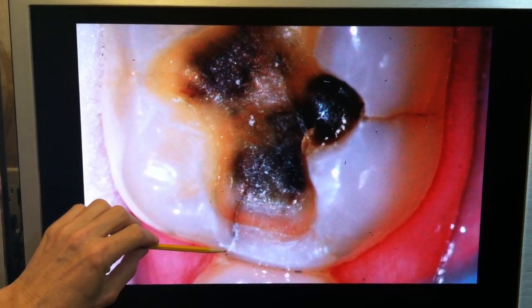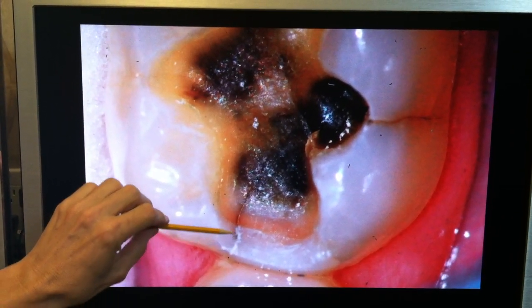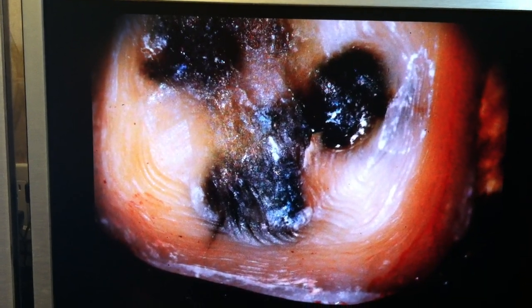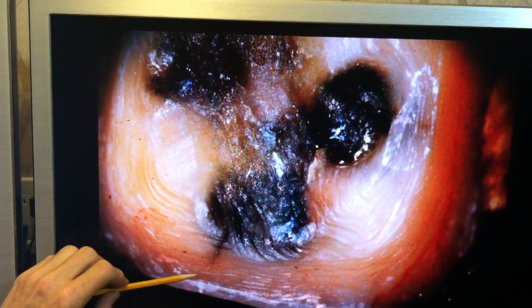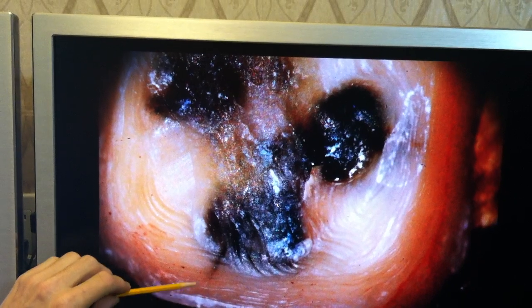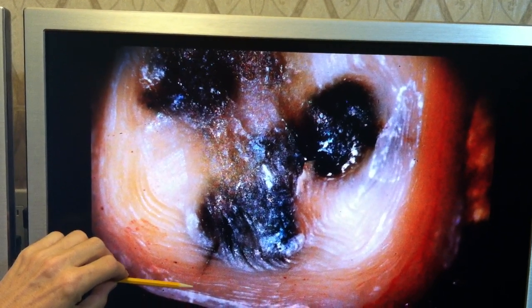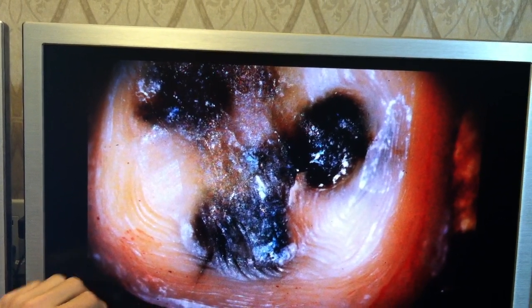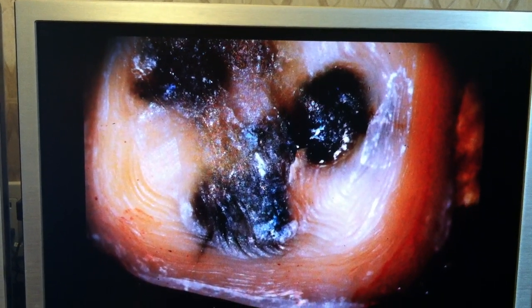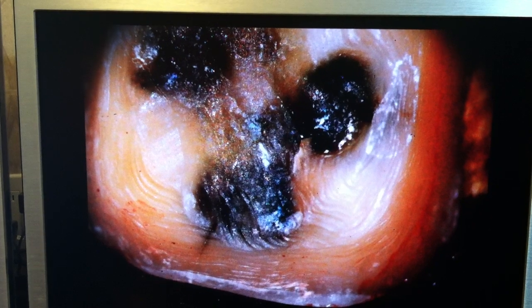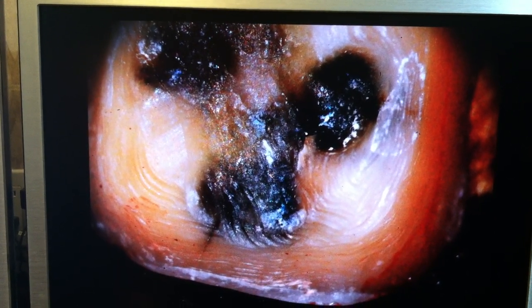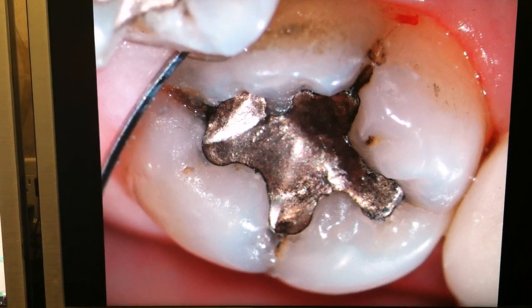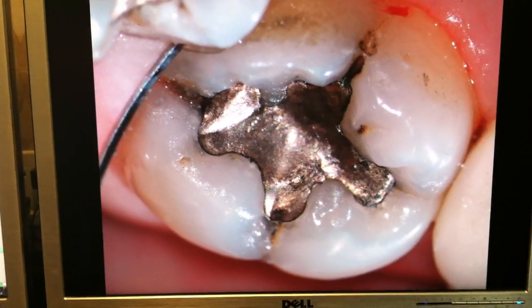With just a little bit of different contrast on the digital image, you can see the fracture a little bit clearer coming in through here. The tooth was then prepped for coverage, or for a full crown cap. You can see the fracture coming down and tapering out, and we feel like we're below the fracture line with the edge of the crown — so we're going to try to tie this tooth together. The crown was placed, and the tooth has been asymptomatic in service, improving the prognosis significantly.